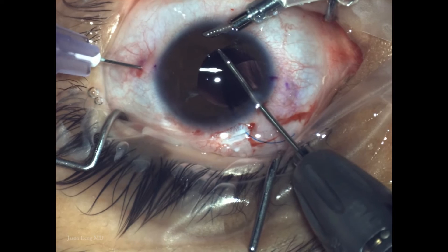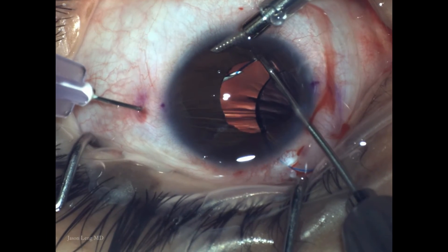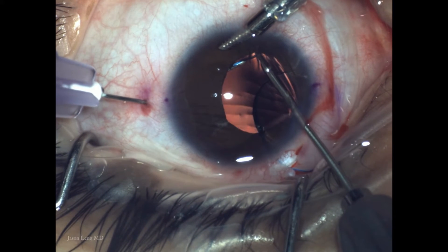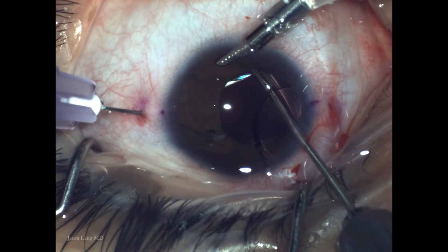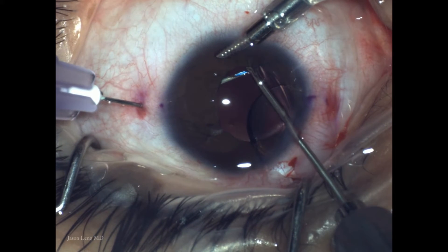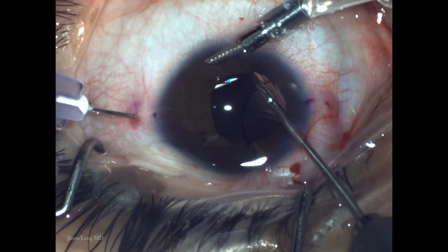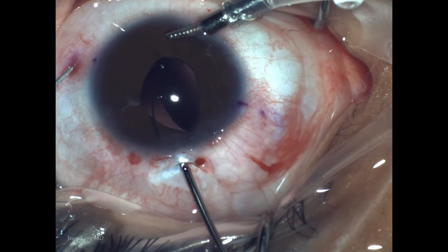Next I'm using MST micro holder forceps to grasp the haptic and introduce it into the lumen of the needle. It's very important to be really direct and coaxial, otherwise you'll get stuck and risk bending or breaking the tip of the haptic. I'm holding the hub of the needle with my fingers.